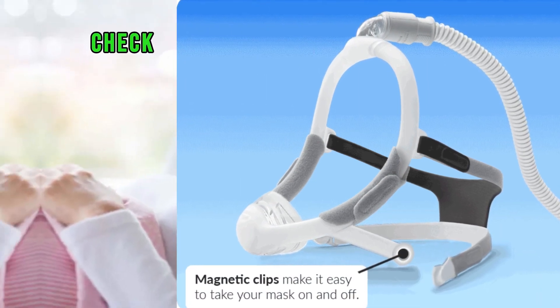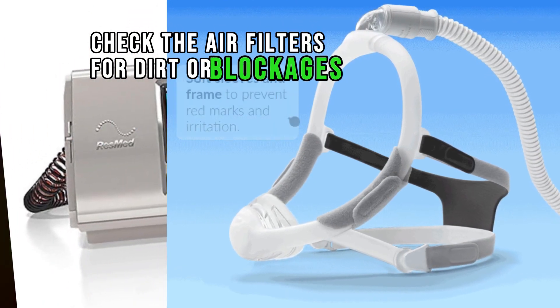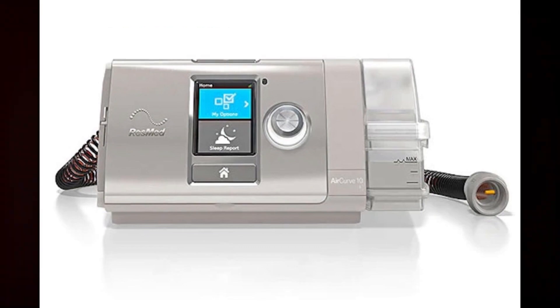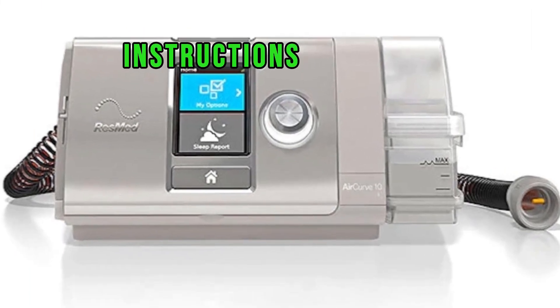Examine filters. Check the air filters for dirt or blockages. If the filters are dirty, clean or replace them according to the manufacturer's instructions.